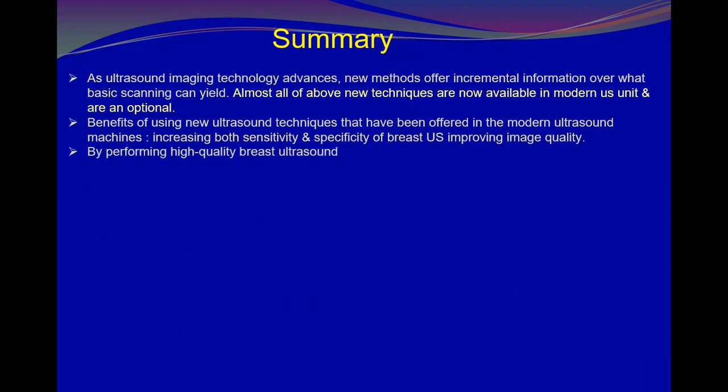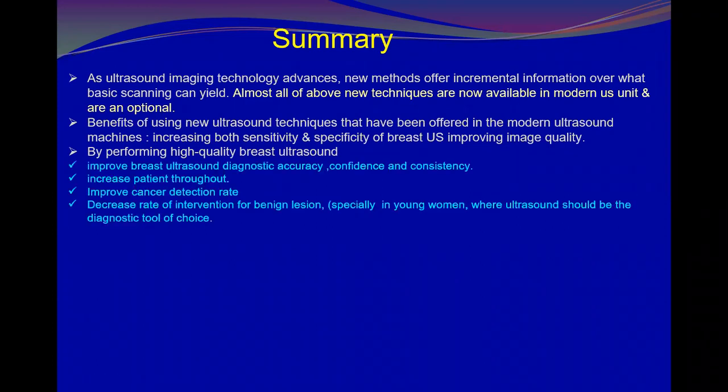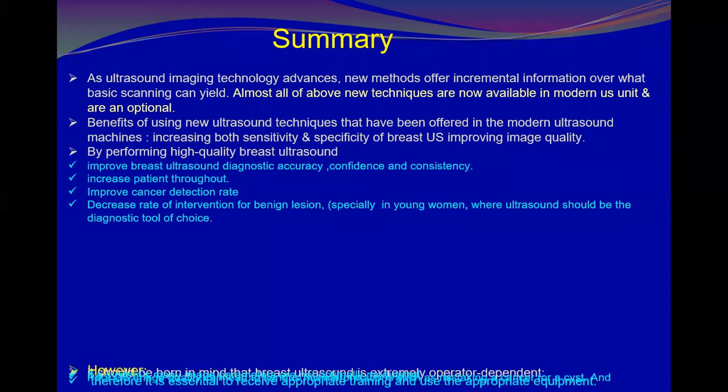So by performing high quality breast ultrasound, definitely will improve breast ultrasound diagnostic accuracy, confidence, and consistency. Will increase patient throughput, will improve cancer detection rate, at the same time will decrease the rate of intervention for benign lesions, especially in the young woman where ultrasound should be the diagnostic tool of choice.